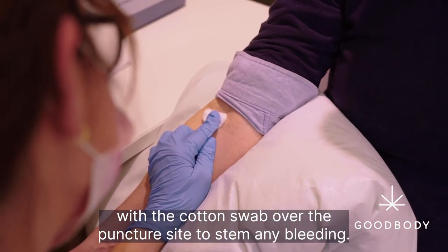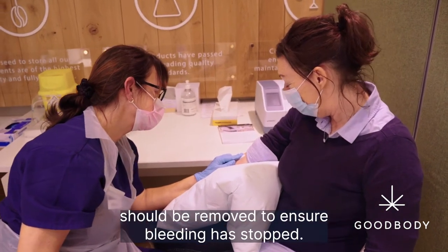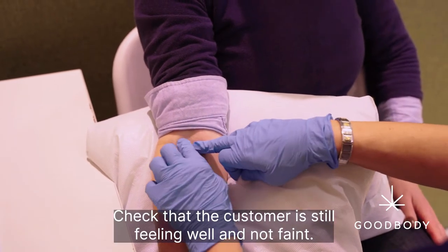Apply direct pressure with the cotton swab over the puncture site to stem any bleeding. This should be carried out for two minutes, after which the swab should be removed to ensure bleeding has stopped. Check that the customer is still feeling well and not faint.